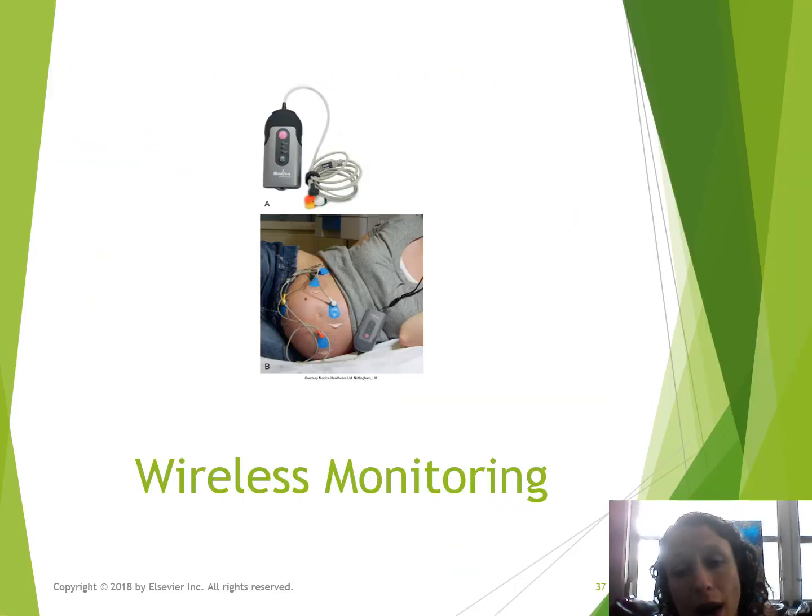This also shows you wireless monitoring. So this is another option. I'm not sure which hospitals have it. I know we had it at my old hospital, but it was created actually for obese patients because it made it easier to monitor them. It actually works better with an obese patient versus a patient that is just all baby, all belly.